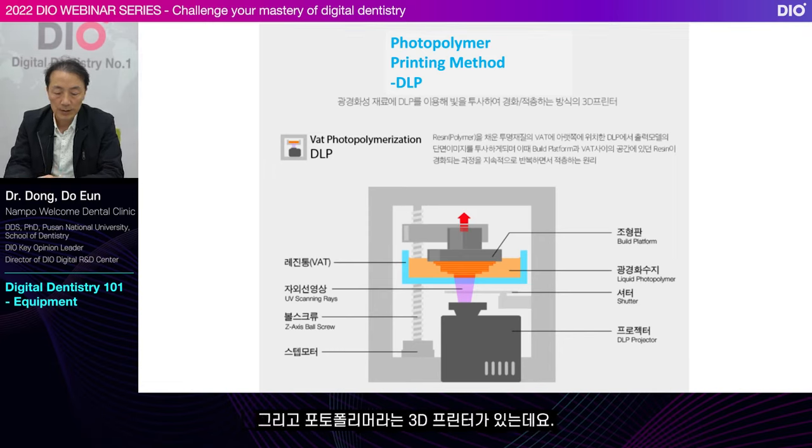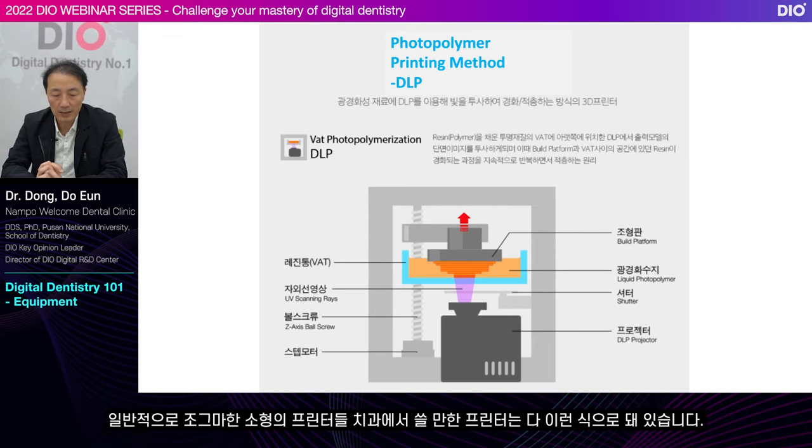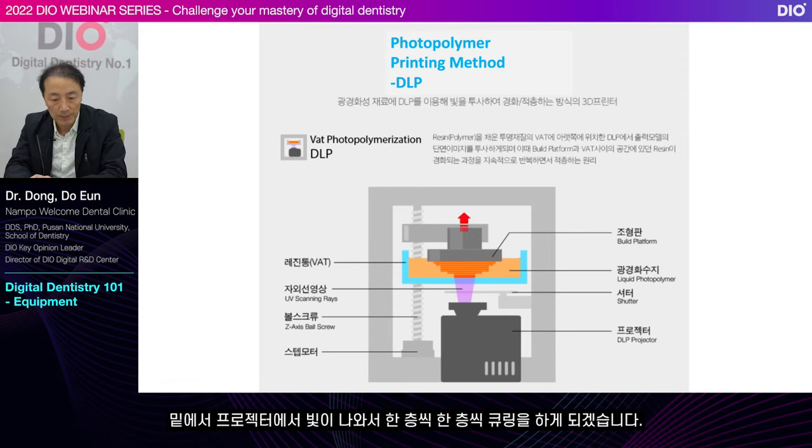There is also a 3D printer called photopolymer. It's called the DLP method. In general, all small printers and printers that can be used in the clinic are like this. The previous one is very expensive, so it's hard for small to medium-sized clinics to have. From the projector on the bottom, light is emitted to cure one layer at a time. Let's watch another video.